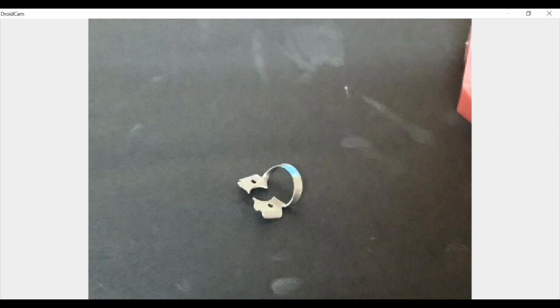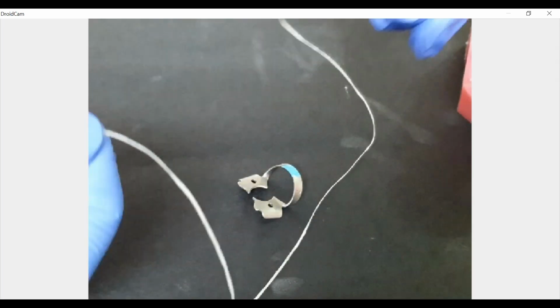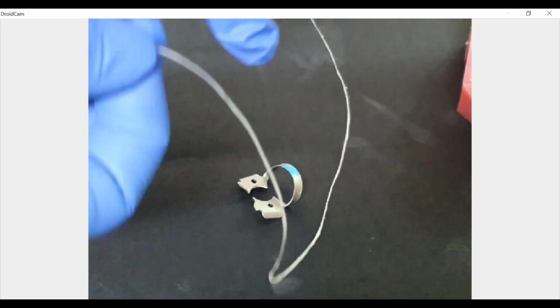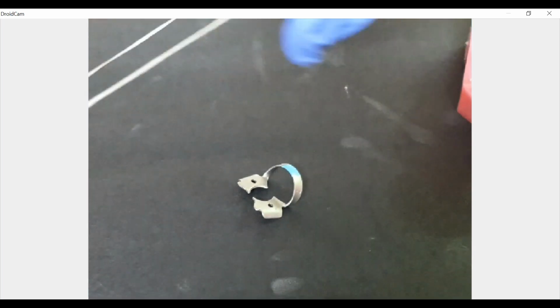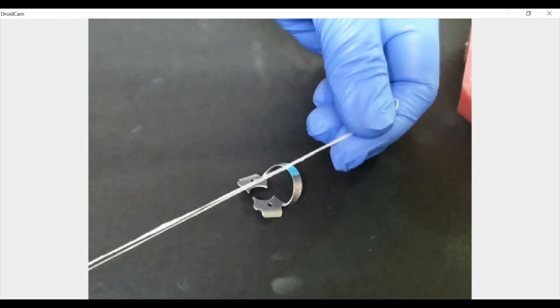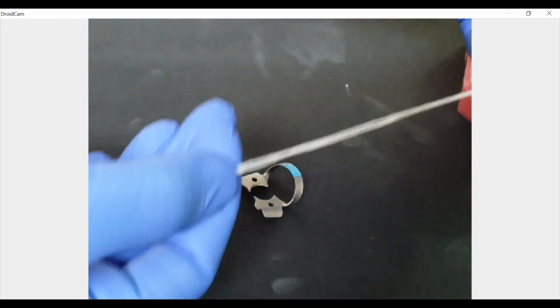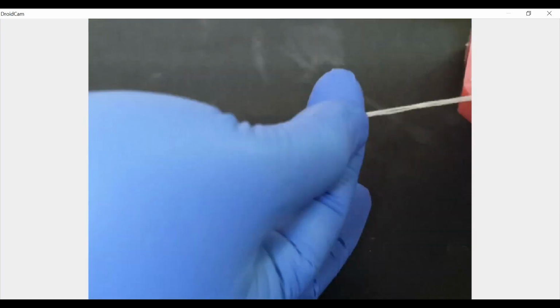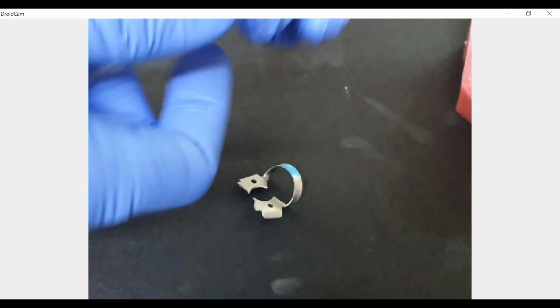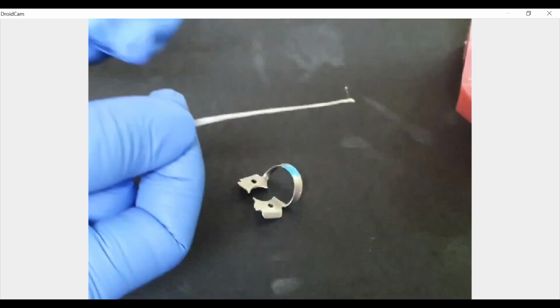Okay, take a sufficiently long floss. Now this will also depend a lot on operator convenience, because if you make it too long, it will all fall out from the angle of the mouth. And if there is saliva drooling from the angle of the mouth, it will catch it by capillary action. It will transfer it into the patient's mouth. Always remember that you oppose the two ends. Okay, and take this end, make it pointed.